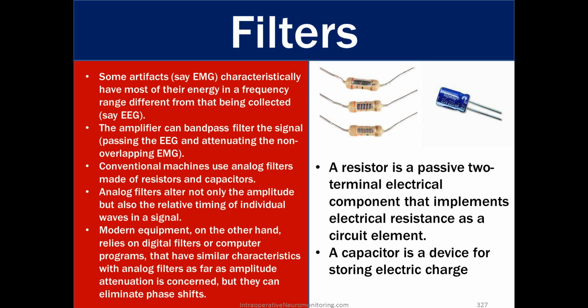So, as I said before in that video, when you're messing around with the filters, we're looking at the phase lag and phase lead. If you're making changes to the analog filters, you will see changes in your amplitude and in the timing. If you're making changes to the digital filters, you will see changes in your amplitude, but not in the onset latencies.